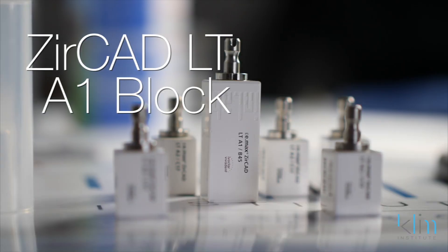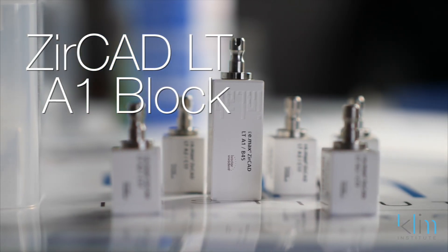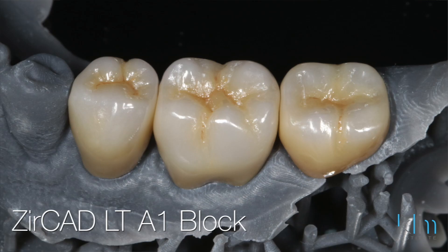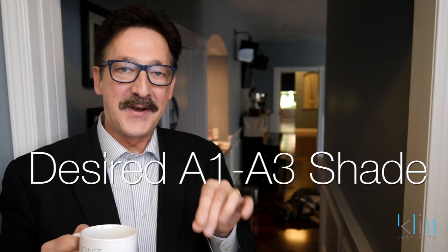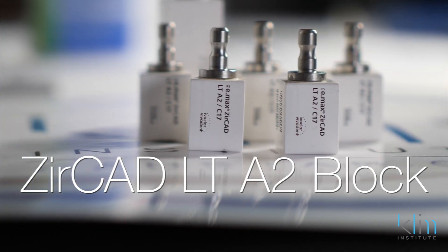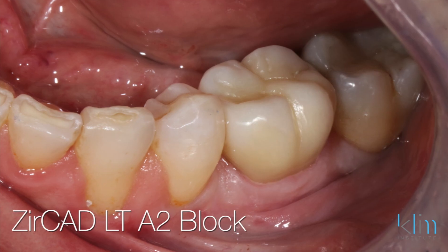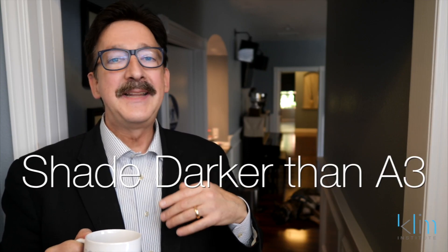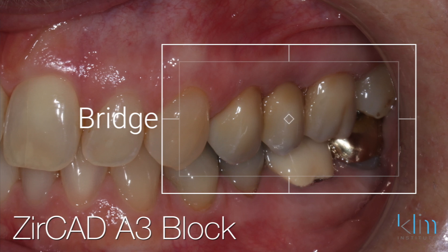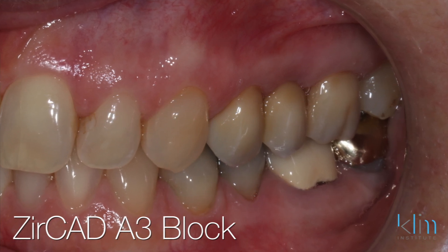Here's my basic block color selection for the Zircad LT. If I want a final shade of B1 and brighter, I'm going to use the A1 block and then tone in my multi-effects. The number of applications applied will impact the saturation, hue, and also the value of the cusp tips. When I want to shade between A1 and A3 for the final restoration, I'm going to choose an A2 block and use the coloring liquids to tone in the saturation and multi-effects. When I want a restoration darker than A3, whether in the A zone or the C zone, I'm going to use an A3 block and tone in the coloring aspects for the multi-saturation effect.